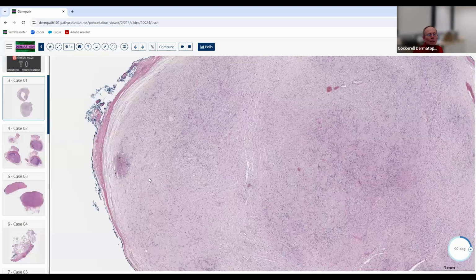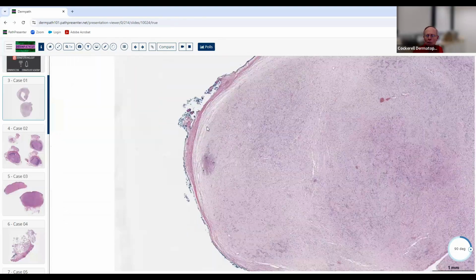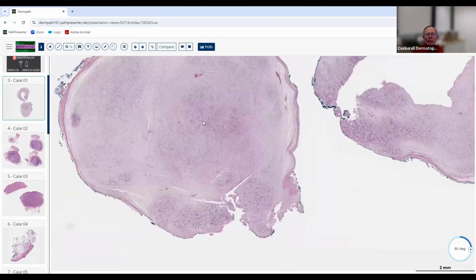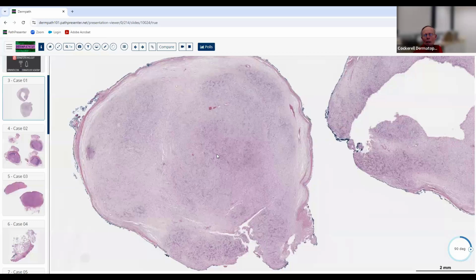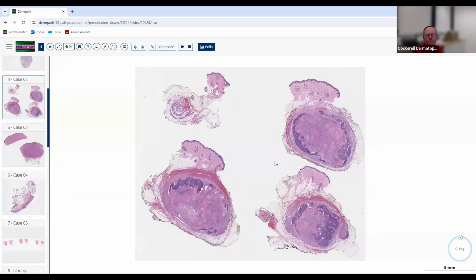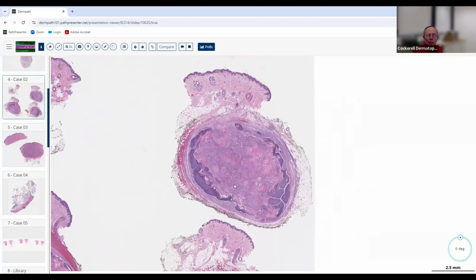So that's pretty straightforward. They could very well ask you this on the boards. It's fair game, an easy one to get. They want to know that you can recognize the difference between a smooth muscle neoplasm, a neural neoplasm, and maybe a fibrohistiocytic neoplasm. They're probably not going to get into all the details of the different types of nerve neoplasms, but they very well could ask you something like that. Very good. Good job. Okay, we'll go to this one next.